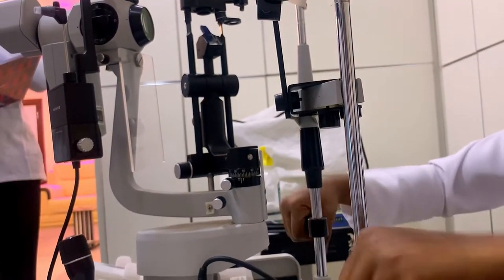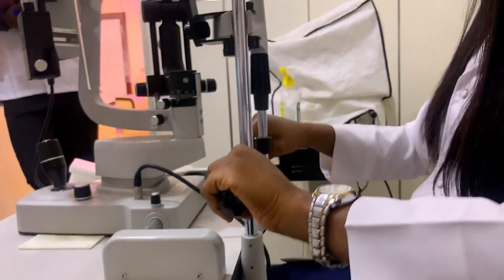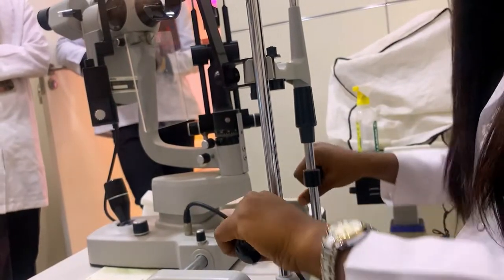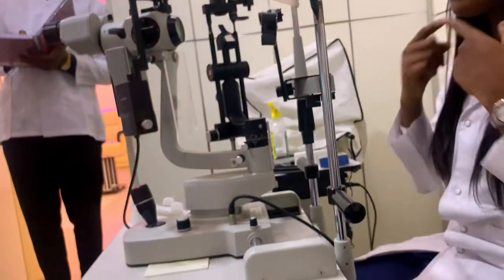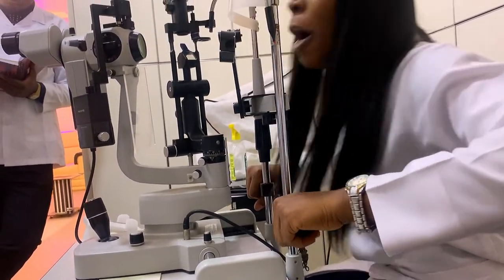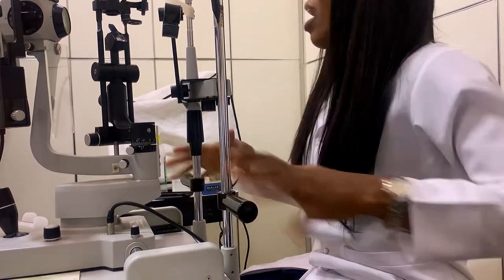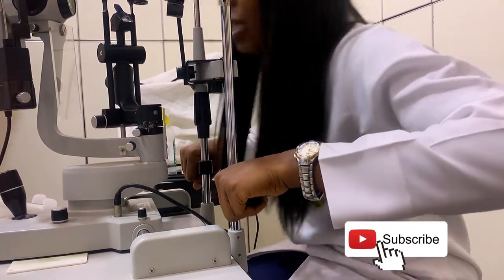Next is the hand rest. This hand rest serves as a support especially for children. Some children when they come always like to hold things, so when they place their hands here, it's like they're driving wheels. Some children when they sit, their chin cannot touch it, meaning they need to stand up and rest their chin. Also for adult patients with Parkinson's problems who lack manual stability, they can hold onto this and rest their chin during the slit lamp procedure.